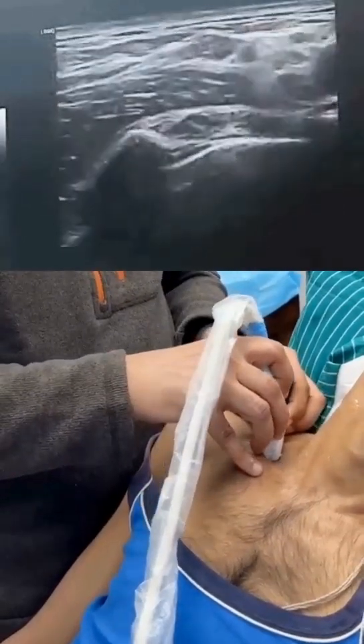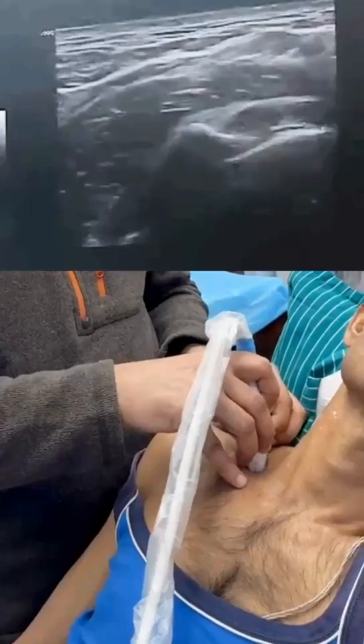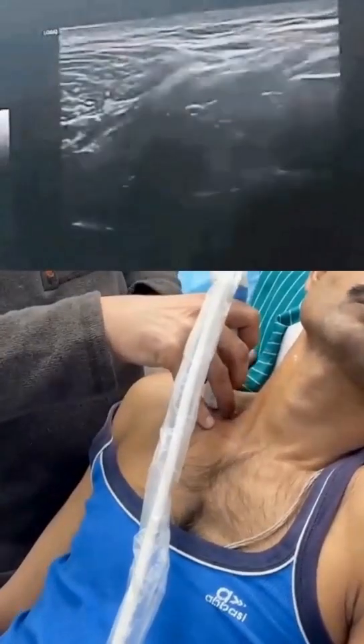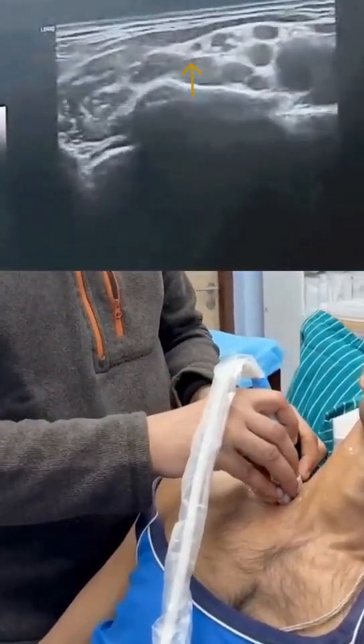The nerve is rising and now you can see it clearly lying below the omohyoid muscle. If I try really hard I can follow it further downwards — I can still see it, right over here. So that's your suprascapular nerve, again joining the upper trunk and coming out.